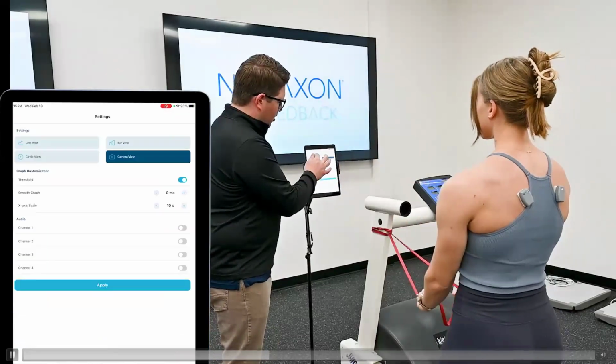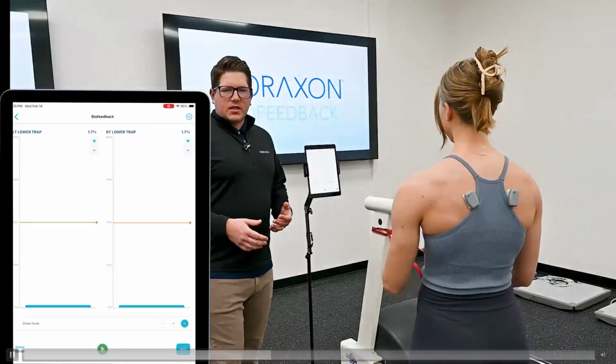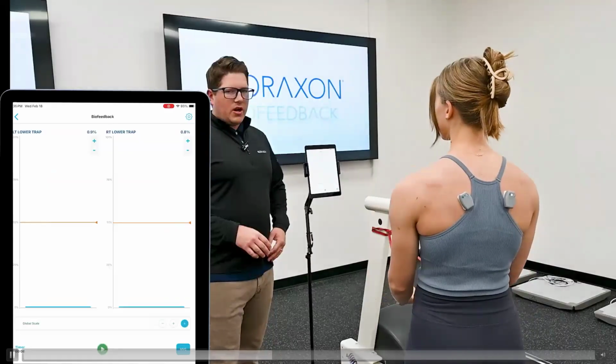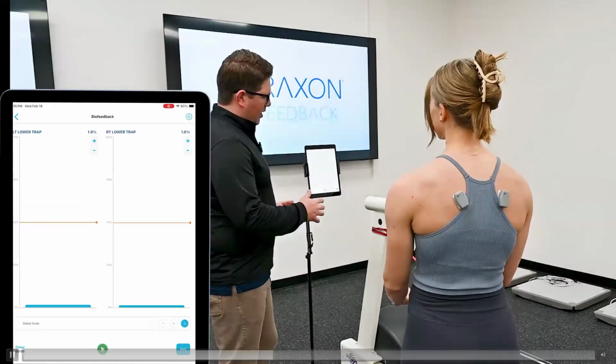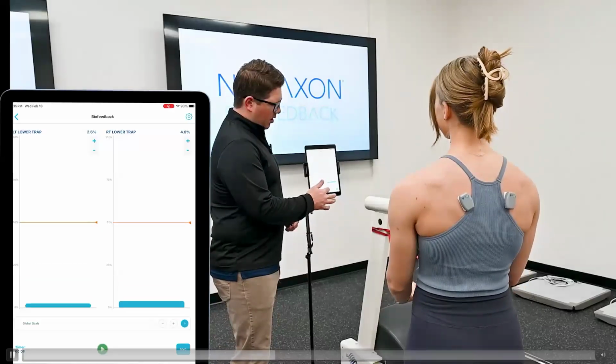So next, what we'll do here is actually make a recording. So we'll go back to our bar graph view. Lindsay's going to complete a couple reps just trying to get across that 50% threshold, and then we'll take a look at the results. You ready? Yep. And go.